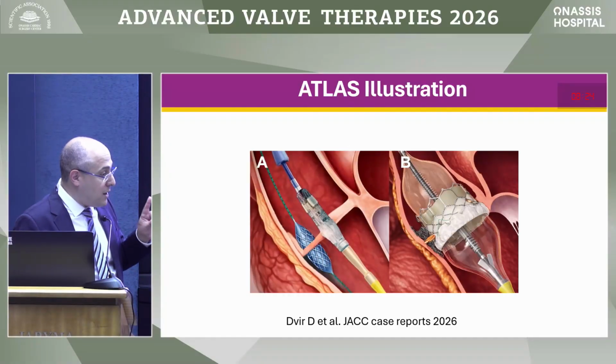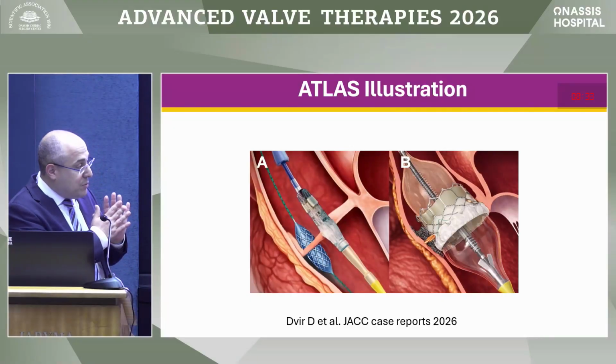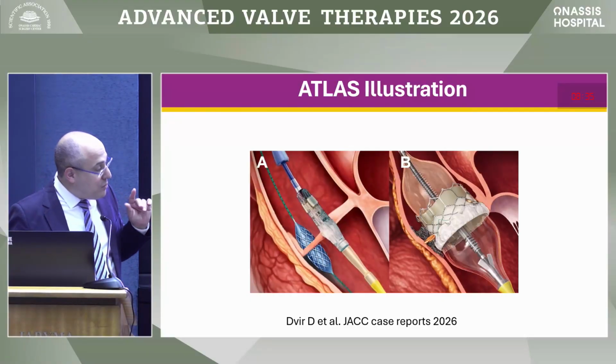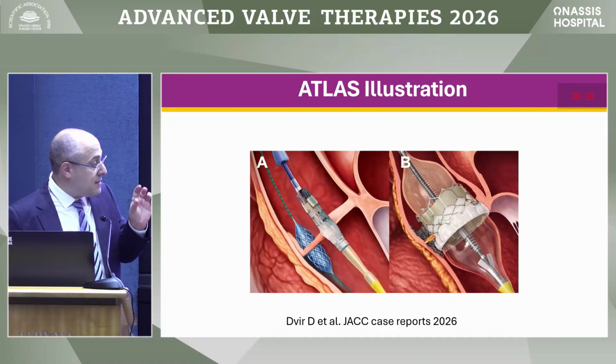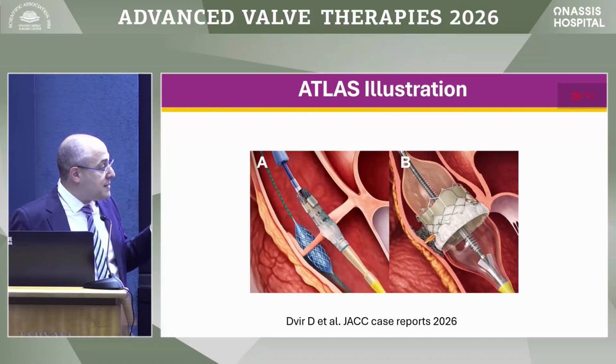You cross the non-coronary cusp with a wire, but you escalate into a stent, a peripheral stent. That stent is being deployed through the leaflet. Through the leaflet. Yes. The valve is through the orifice and the stent is through the leaflet. You deploy the stent not nominally. It's still. It has a waist in the leaflet.